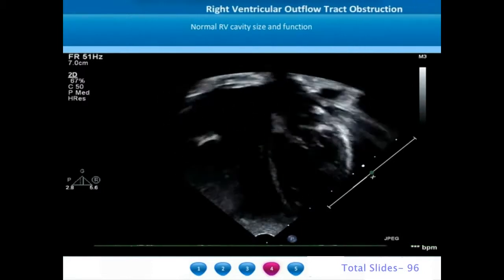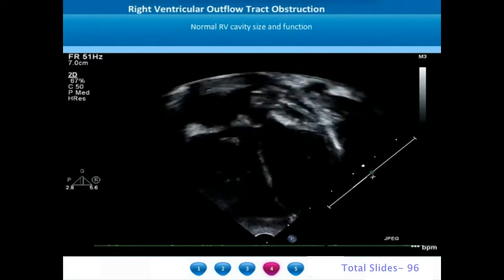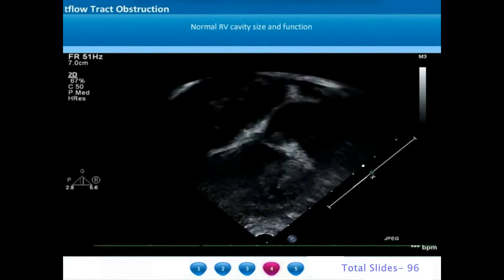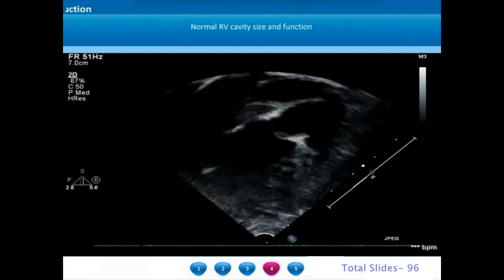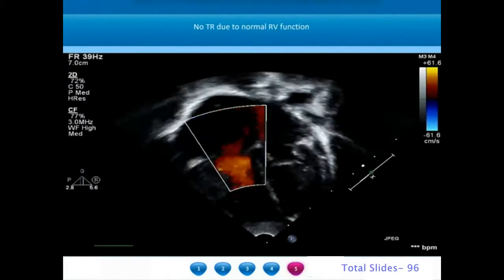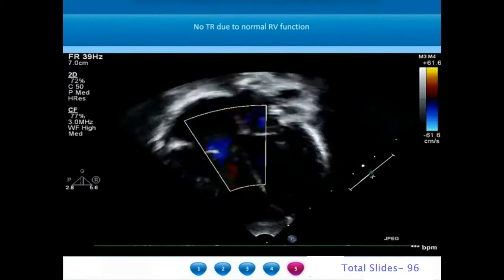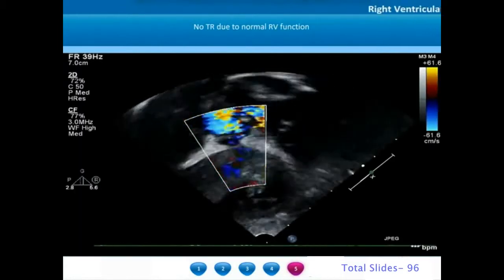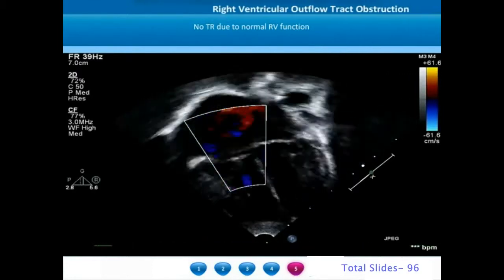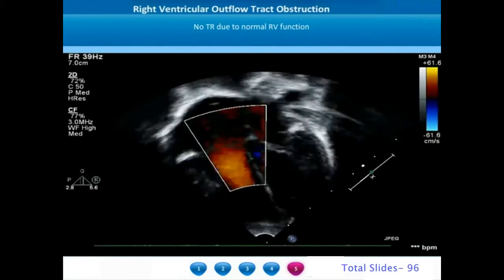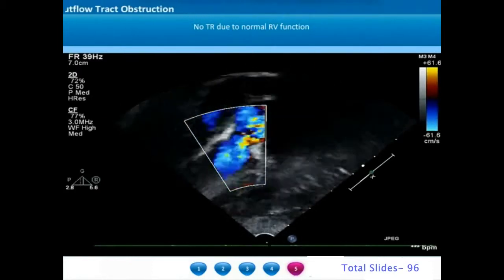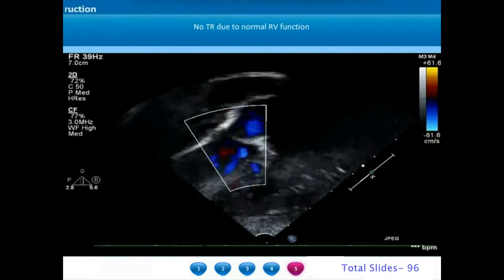In this apical view we can appreciate a normal-sized right ventricle, and on an anterior sweep we can identify the right ventricular outflow tract and the doming pulmonary valve. On color Doppler interrogation in the same apical view, we notice there is no tricuspid regurgitation, right ventricular contractility is good, and there is turbulence across the pulmonary valve.